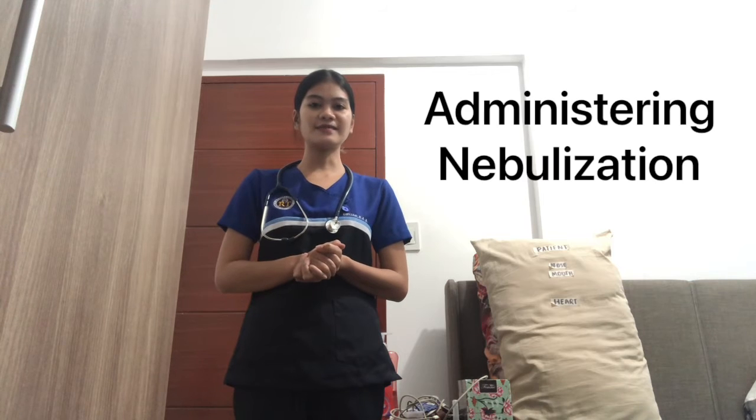I'm Miss Almera Iberwar, your RT intern, and today I will perform a return demonstration in administering nebulization.